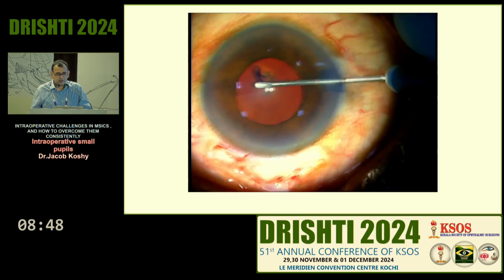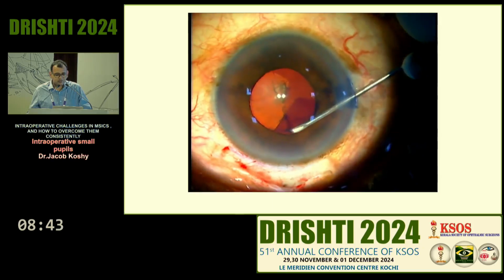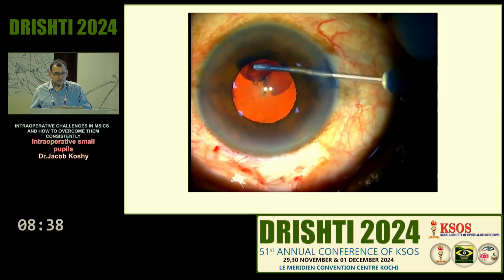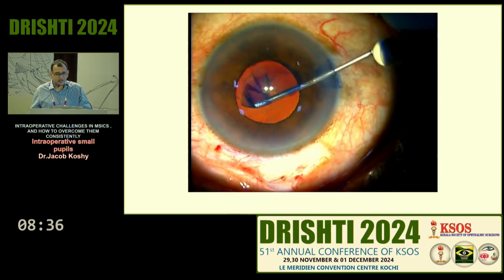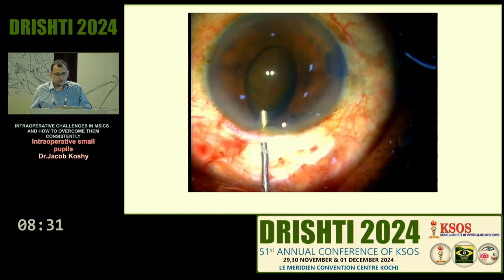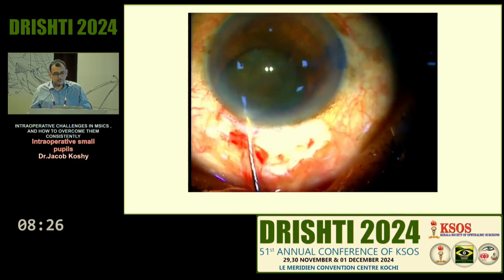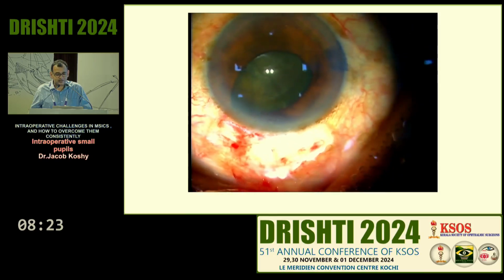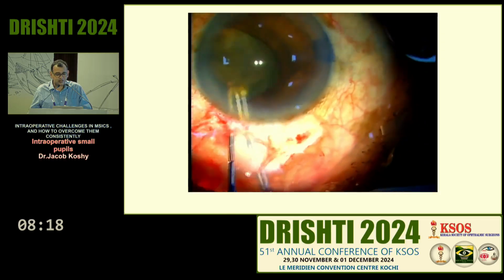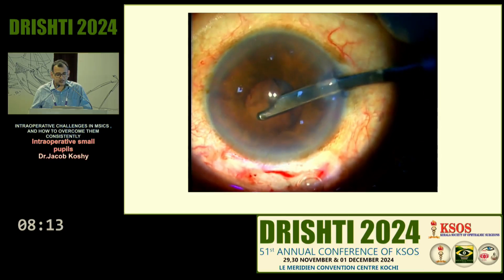Now here is another patient, fairly small pupil. So we think that we can manage these, and many of these things we are doing in a hurry because you might want to finish the list fast, and you do a blind rhexis, like I said, and things are going well. You prolapse one end out, start rotating. Sometimes getting this nucleus out of the PC into the AC itself is a challenge. You remember, use the two-hand technique. It makes things a little easier.